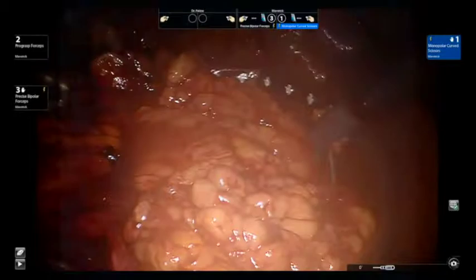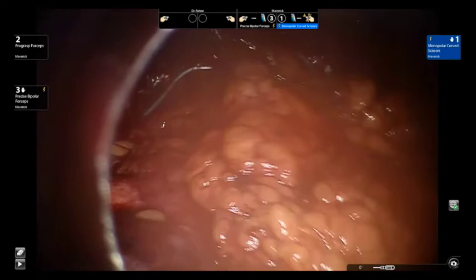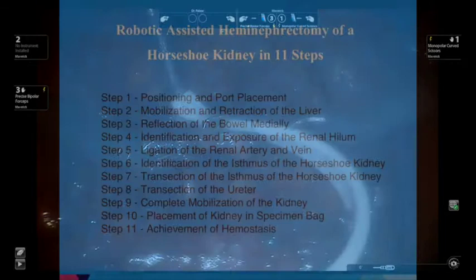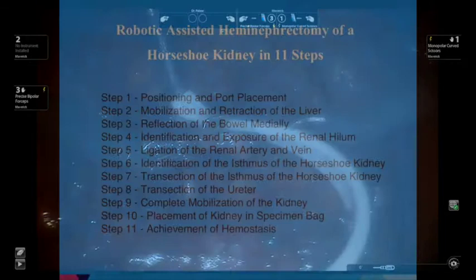Now fully mobilized, the kidney is placed into an endo-catch bag for removal prior to closure. The hilar bed and isthmus are inspected to ensure hemostasis. A Jackson-Pratt drain is then passed through the lateral robotic port. This concludes our presentation on the 11 steps of a robotic-assisted heminephrectomy of a horseshoe kidney.